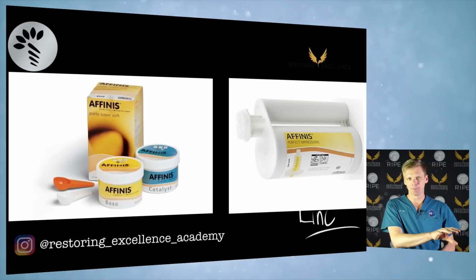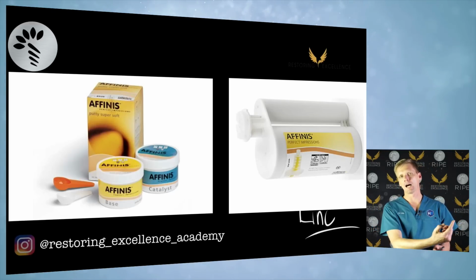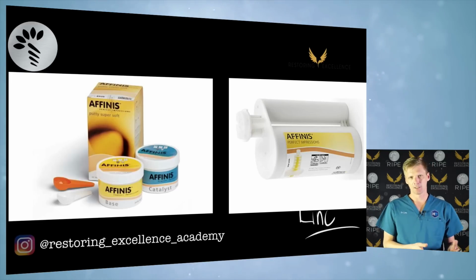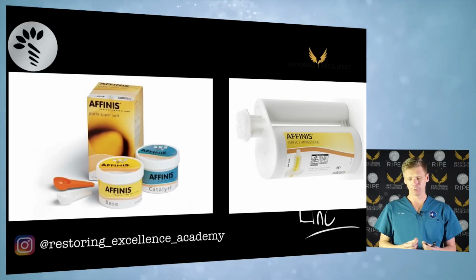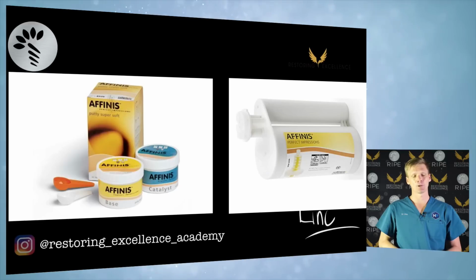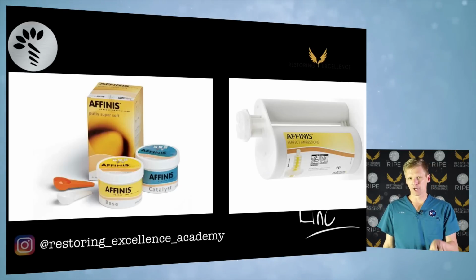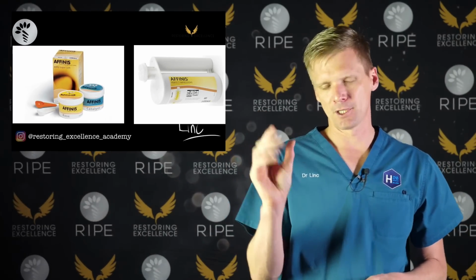Now I use both heavy body and putty. If I'm doing a whole arch of crown preps, so where I've got 360-degree margins, I'm much more likely to use putty. Putty is not quite as accurate and you've got to be much more careful with how you mix it, so your assistant needs to be very well trained. It has to be used in a very robust tray because it will make the tray distort and then you will get preps that are too small.